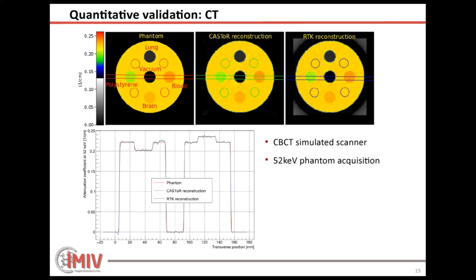But also for CASToR, as we needed to use a different voxel size than the one optimized for the Biograph, we used the Siddon in the projector. If we use the Joseph implementation, which is the one used in Siemens... In fact, Siemens use an unmatched projector, which is the Joseph one for forward, and the voxel driven implementation for the backward. But anyway, we used the Siddon, so we had an advantage from that. If we use Joseph, I think the Joseph projector in CASToR is about 1.5 to two times slower than Siddon.